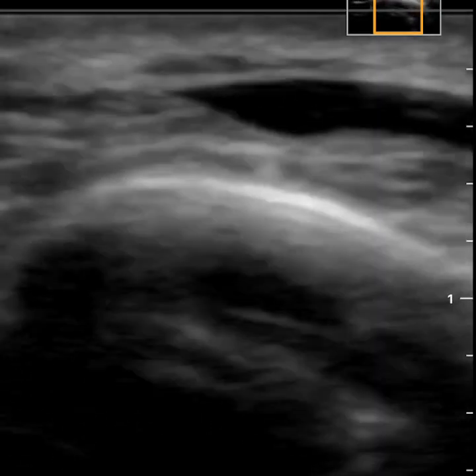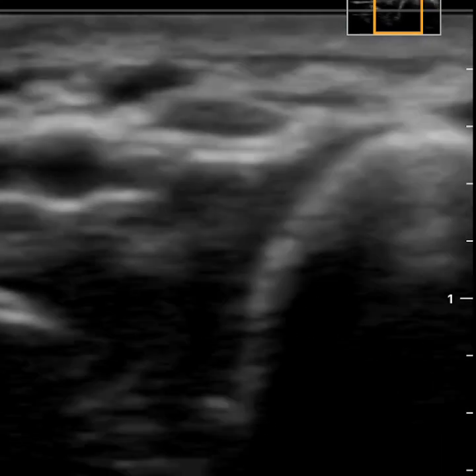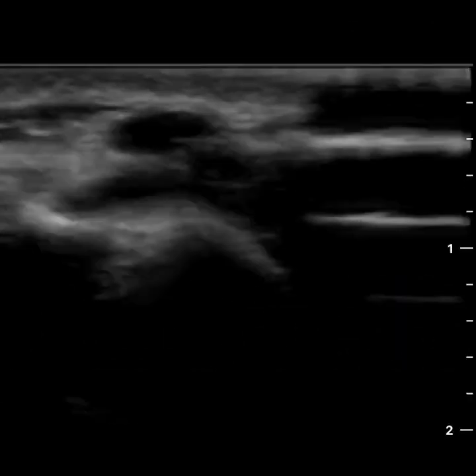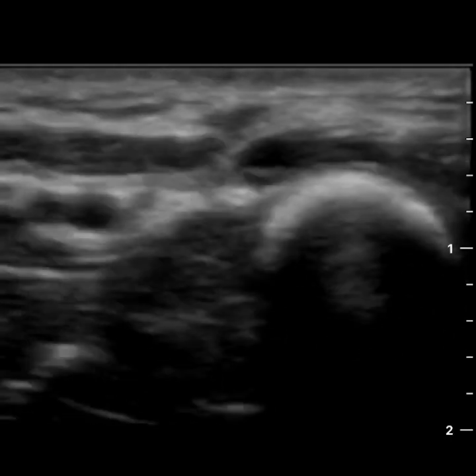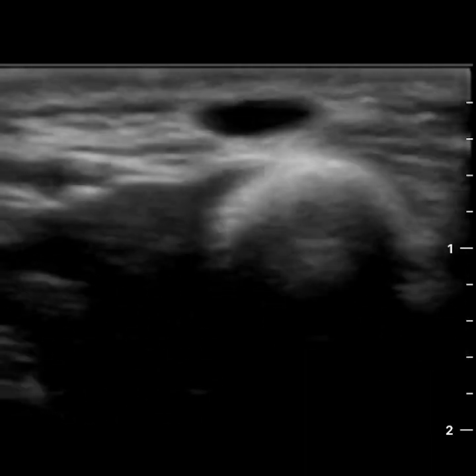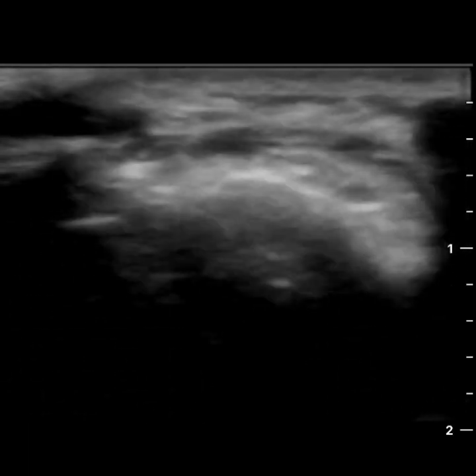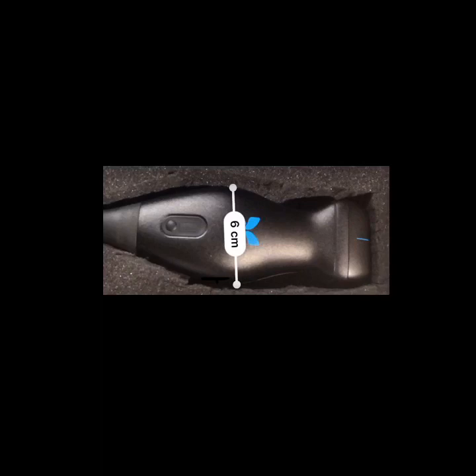Then I switched the preset over to the MSK preset to see if that helps with the differentiation of tissues. Here we are with the MSK preset. You could argue that there's a little bit more contrast or brightening in the fascial layers, but overall there's really not much of a difference. The dynamic range is actually less in this particular near-field example. So overall, I didn't really enjoy either of these presets for sub-centimeter tissues.